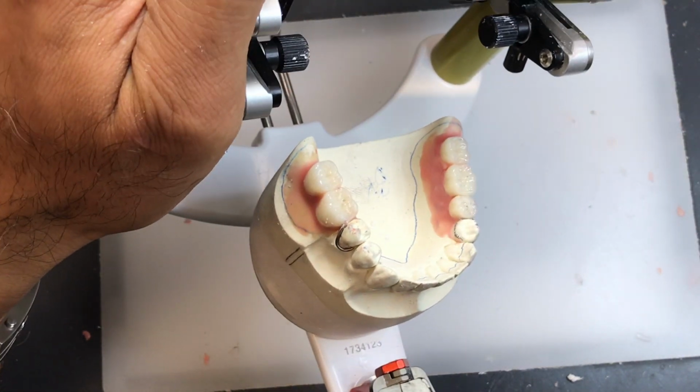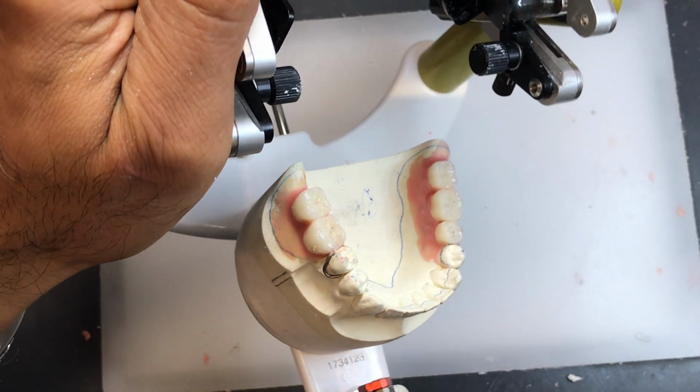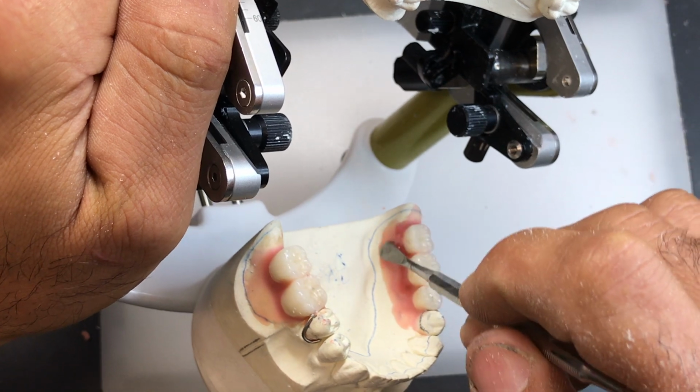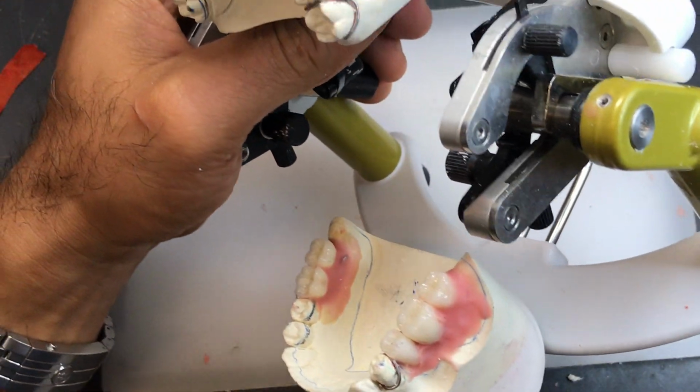So once you get the whole tooth arrangement on there, the section that you're working with, it gives you a better sense of how everything is lining up. So you might have to go back and tweak things a little bit, which is quite common.